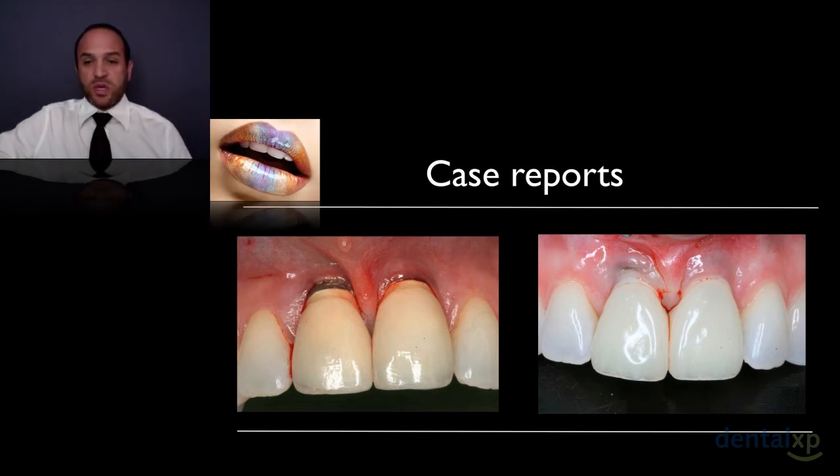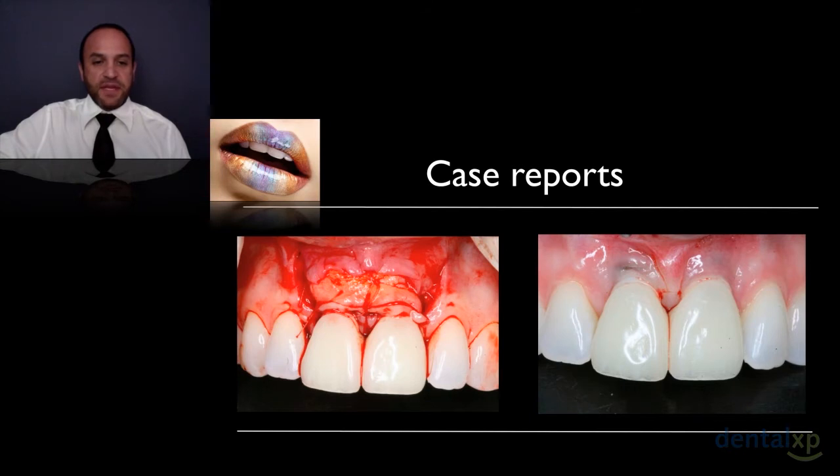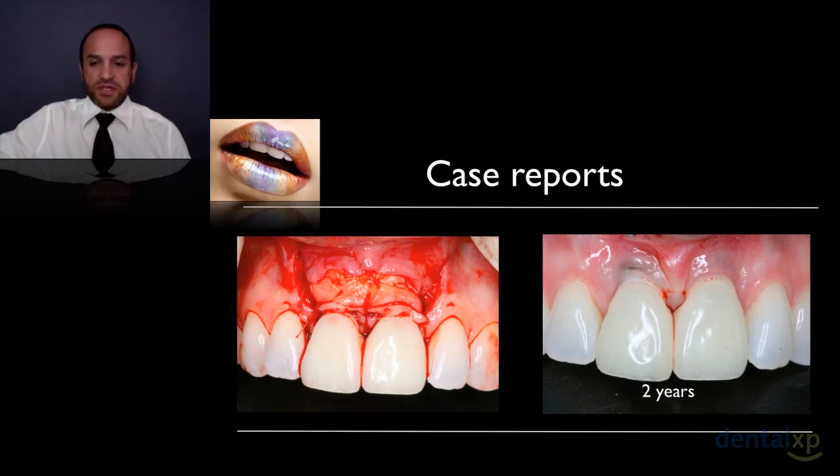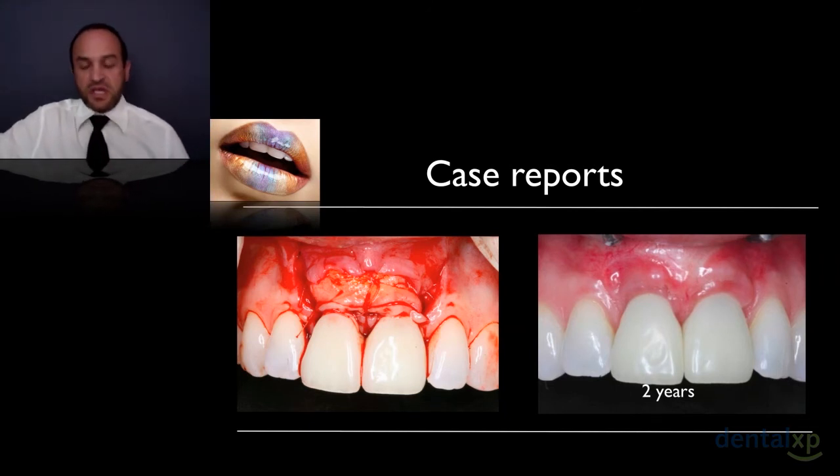And here you can see as well the first thickening up of the gum. We did the multiple gum grafts. The first one was a tunnel technique to repair this. And you can see after there you can see the second connective tissue graft coming there with coronal repositioning of the flaps. And you can see after 2 years you can see what we had. We had now got it to not a perfect result, there's no debate about that, and we're never going to get a perfect result, but taking back from where we went with the frenectomy, from where we've come to where we are, a much better result.